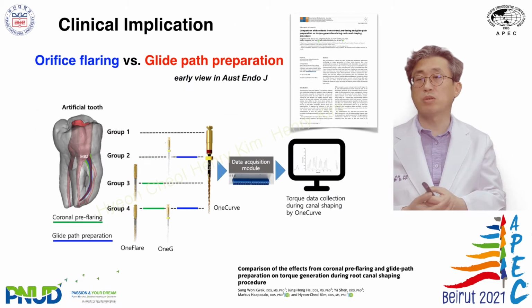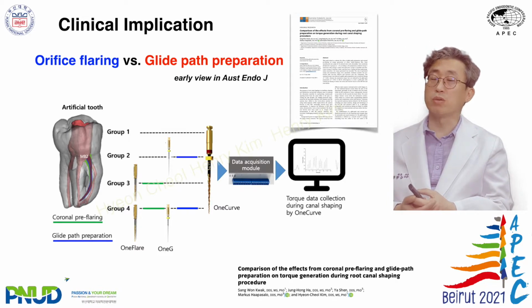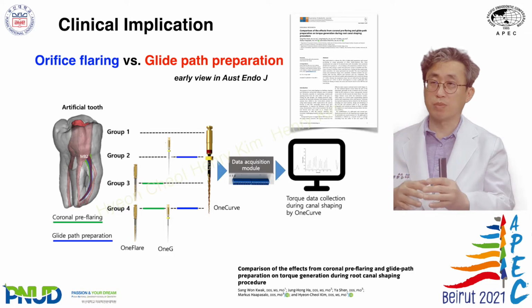This is the most recent study. It is recently published online at the Australian Endodontic Journal. In this study, we tried to see the torque generation after coronal flaring and or glide path preparation.